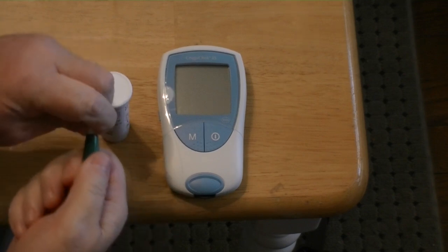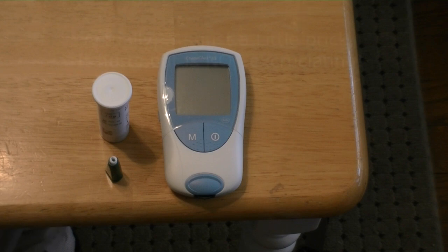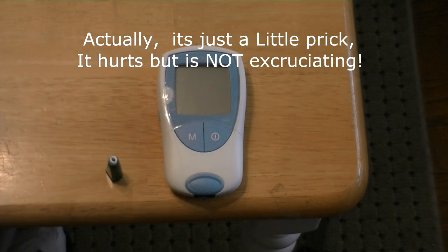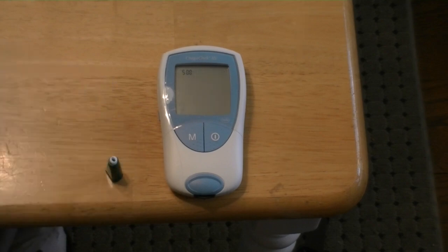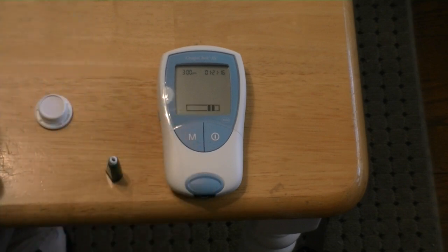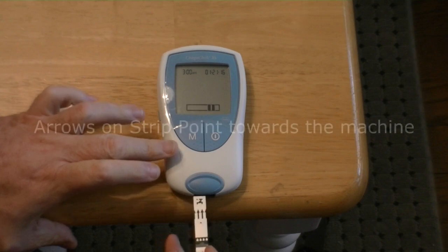You simply take the lancet, twist off the top, which arms it. When you push that on your finger it pops, gives you excruciating pain, and then you get to pull the blood out of your finger. These are the strips — they come in here along with the chip. You have to turn on the machine and let it warm up just a second. Then you pop open the top, pull out one of the strips, being careful not to touch the gold edge because that's the contact. Then you stick it in the machine.